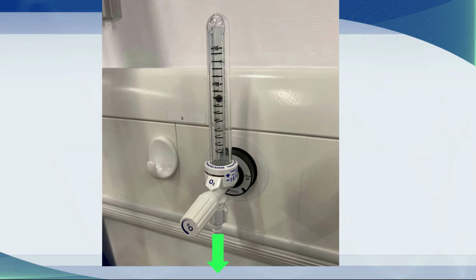And to figure out how much oxygen you're giving, you need to look at the device itself, the flow deliverer, and how much air is entrained. And what I mean by air entrainment is the blending of oxygen and air, usually ambient air, in the room that the patient is in to come up with a precise inspired oxygen tension.